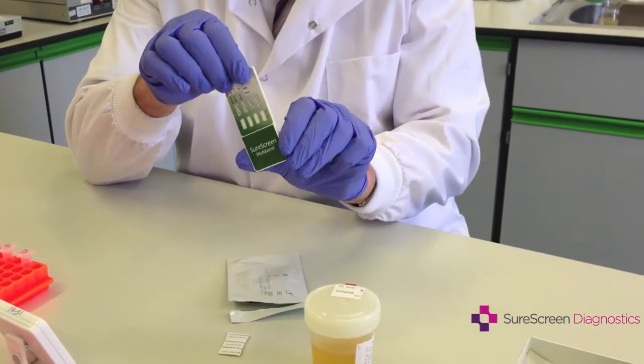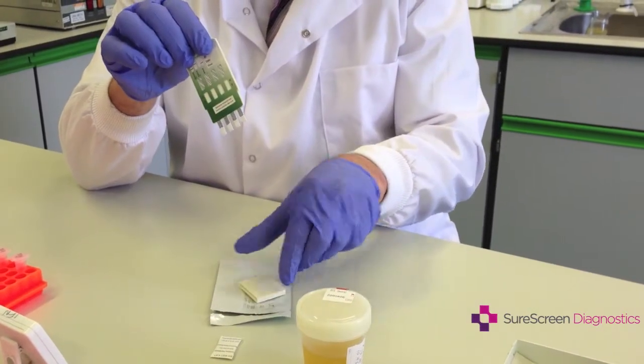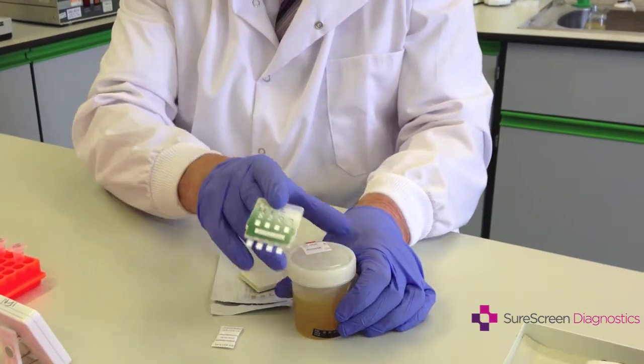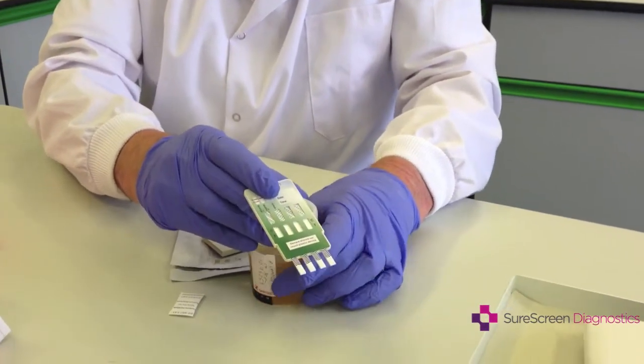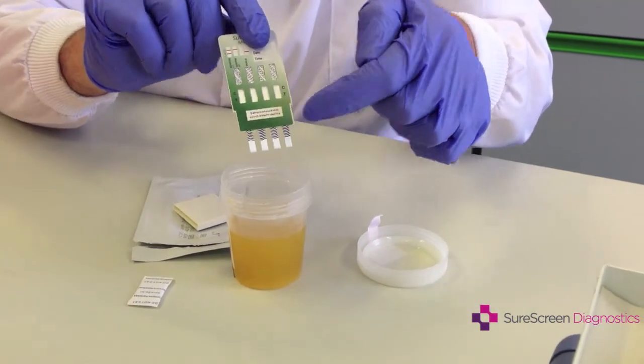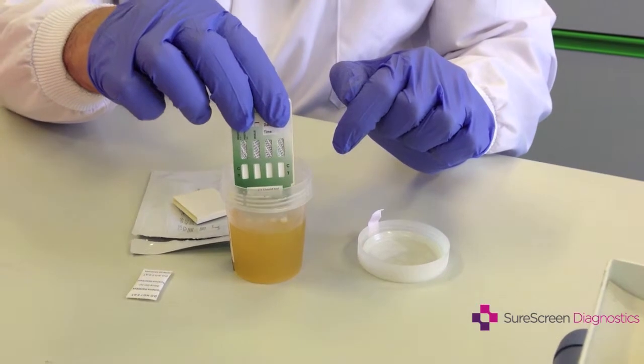This has a cap on it which you remove, and then you place it in the urine sample. Open the top and dip the test in to the wavy lines but no higher.